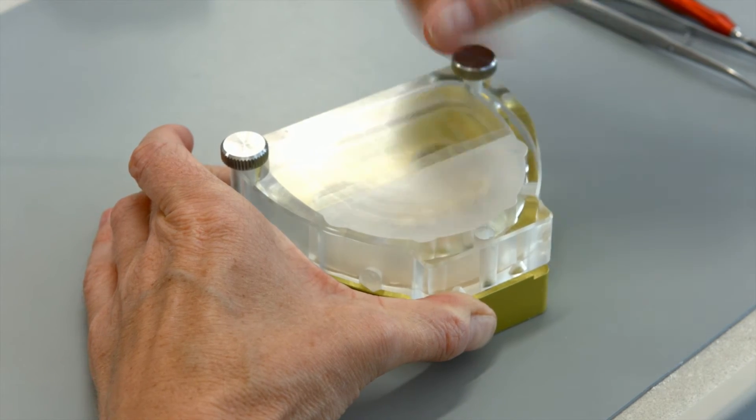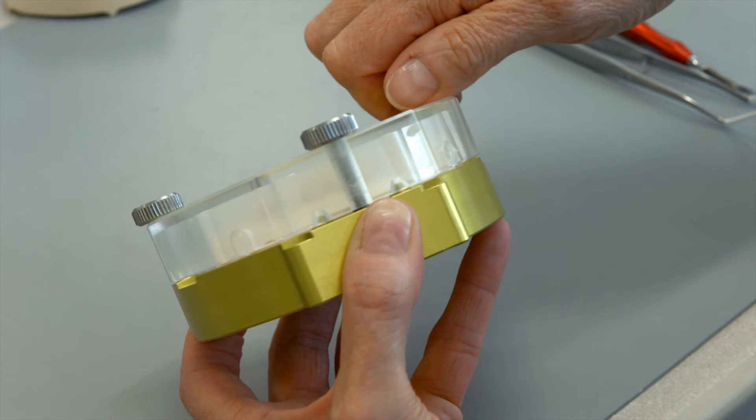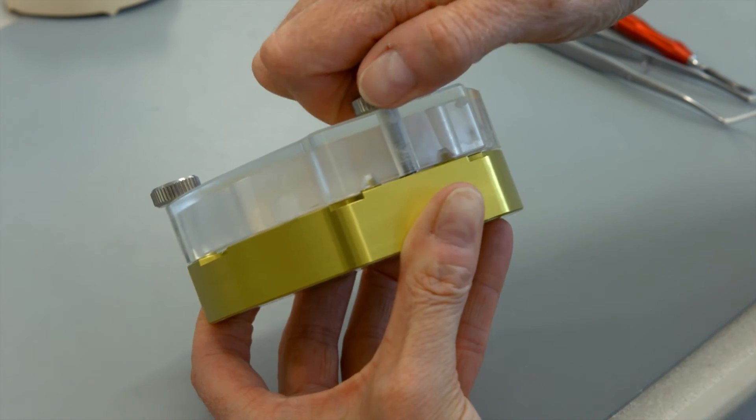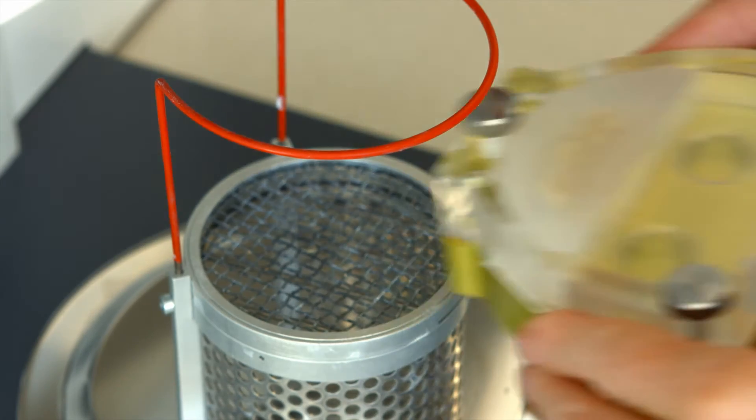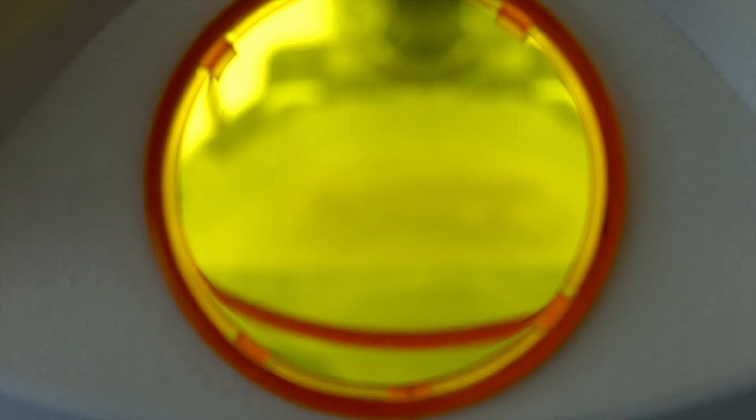Join the flask halves and tighten the screws with one or two turns per screw in a clockwise direction. Place the flask loaded with the incisal material in a suitable polymerization device, for example, the LumaMAT 100, and LightCure.